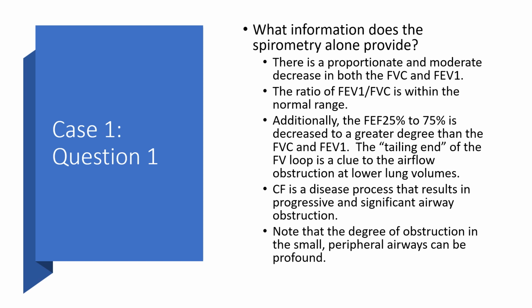We're really looking for somewhere in the 70s, depending upon which book you look at, around 75%. So roughly two-thirds to three-quarters of that breath should be exhalable in the first second. But when forced vital capacity and FEV1 are both reduced to a similar proportion, that percentage is relatively constant.